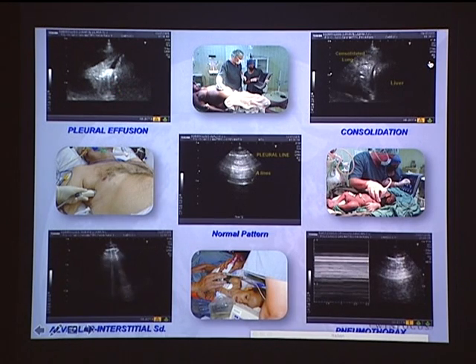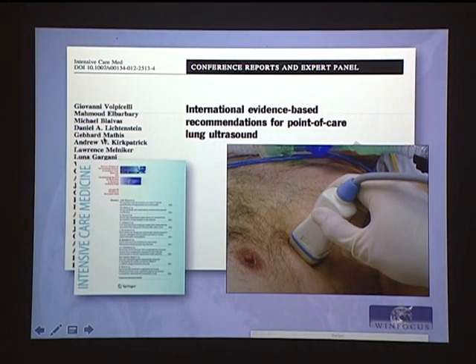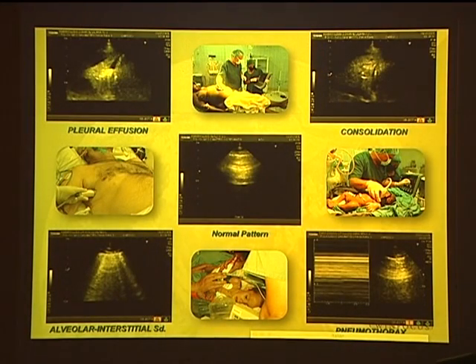And you see that here we have general applications, the more traditional, like the pleural effusion, the consolidation. You see here the alveolar interstitial syndrome or the pneumothorax. We'll systematically overview together how to recognize these different sonographic syndromes.